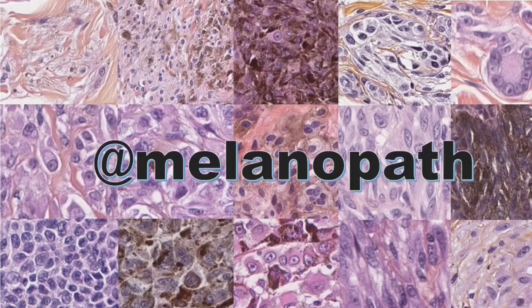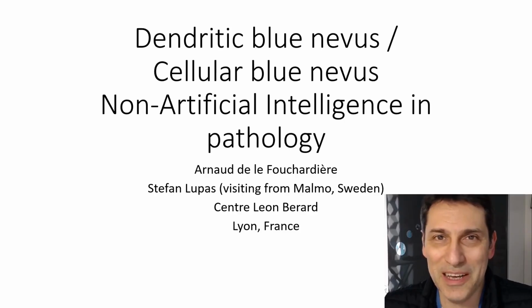At Melanopath. Hello, Arno della Fushadia here. With the help of Stefan, we have prepared a video showing the features of dendritic and cellular blue nevus.